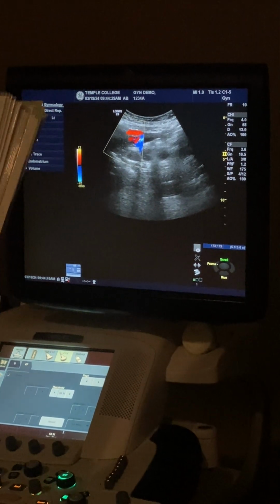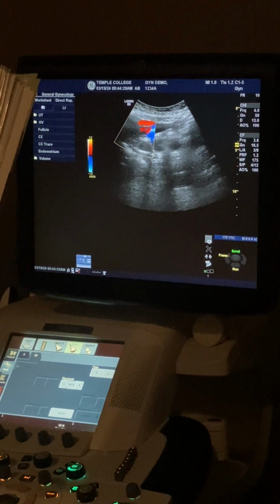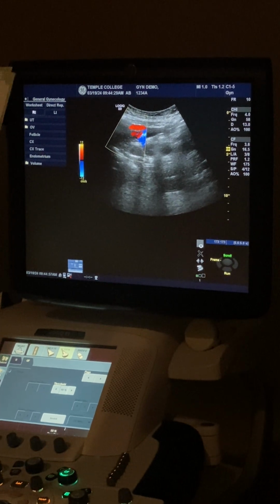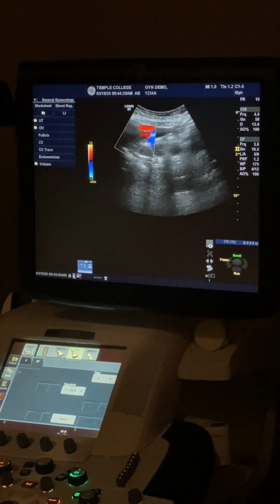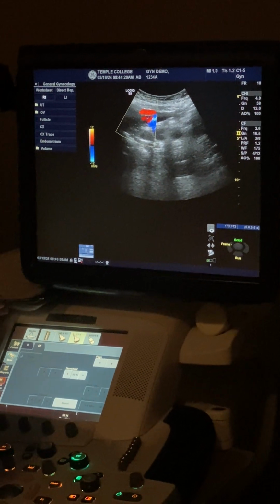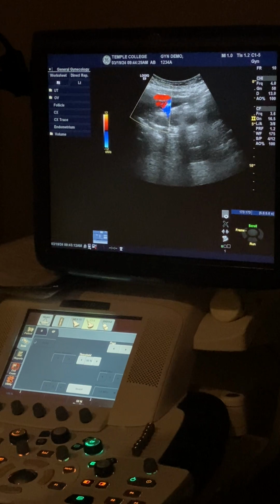Just making sure I don't have it written down anywhere else, that's weird. So this says right adnexa trans. That should be under the long, shouldn't it? Sweep from uterus to lateral adnexa. We need to amend that because that's spelled wrong. Yeah, it's really just like 3 or 4 images. You're showing me the adnexal space in trans and long and a color representative picture.